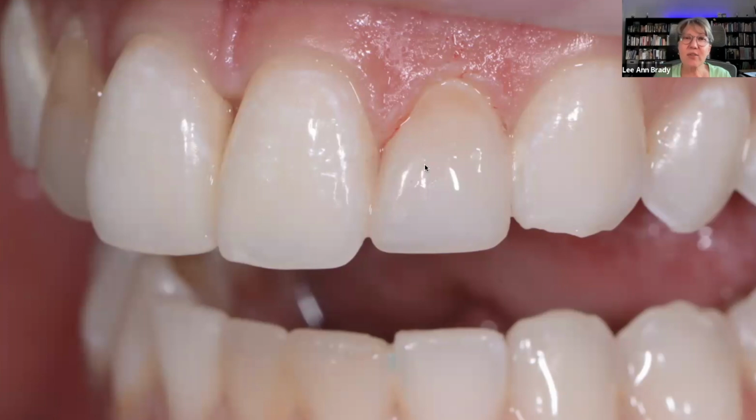Okay. Right now, this is the immediate post op photograph. The whole composite looks a teeny bit more gray, lower value than her central, and it should because her natural teeth are dehydrated. Her natural teeth right now look a little less colorful and a little brighter and whiter than they will in a couple of days. And that's exactly what we aim for.